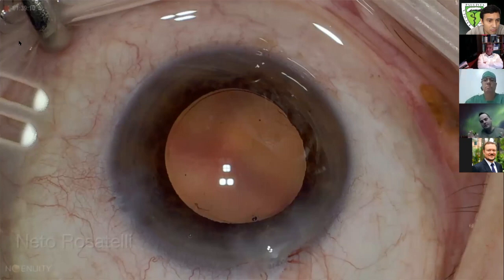But in terms of implanting the single piece IOL, and especially this one, this lens is perfect for this situation. Why? Because you have four independent haptics. And I have done that numerous times. Diagonal optic capture. You can take two of the haptics behind the anterior capsulorhexis and two of the haptics in front of the anterior capsulorhexis. And you achieve stable optic capture with this lens.